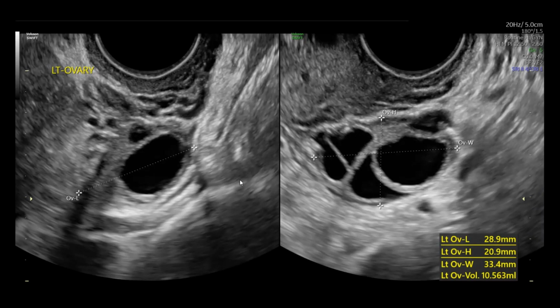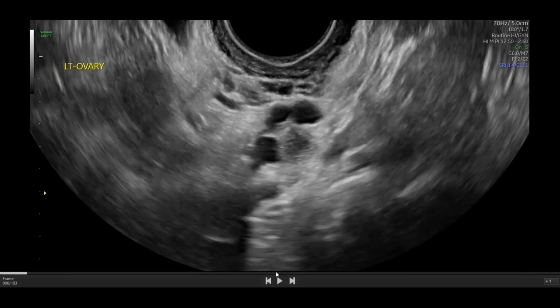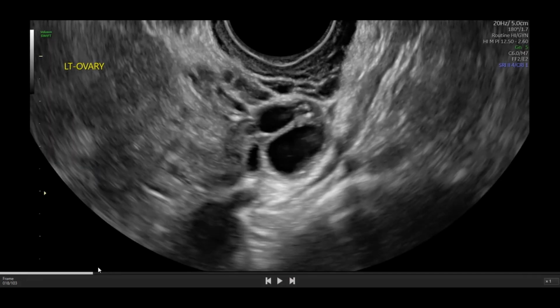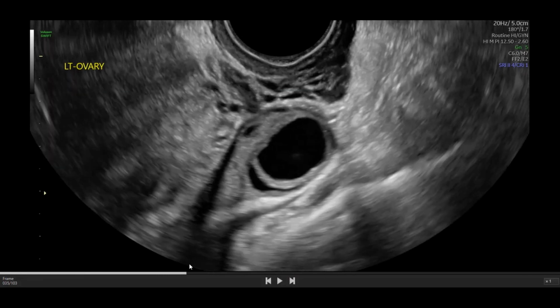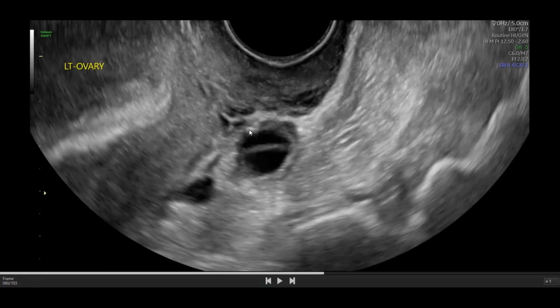But we should never assume, and we should keep everything in mind when we're going through an ultrasound to be systematic. So here's our cine loop through this. There's one sweep through it there and another. I'll stop and we'll go through that slowly and talk about a few things. So as we're going through this here, one thing that's already catching my eye is this little collection here of hyperechoic foci. And then as I scanned through it, we also have a few hyperechoic foci here and then here as well.